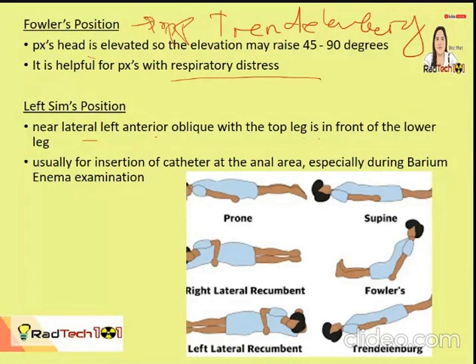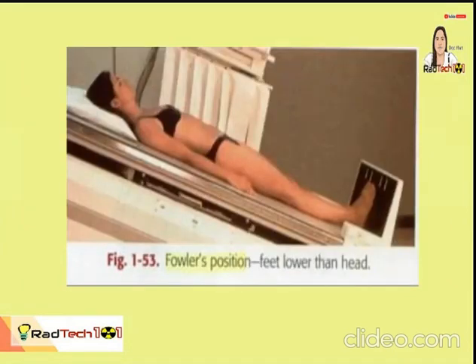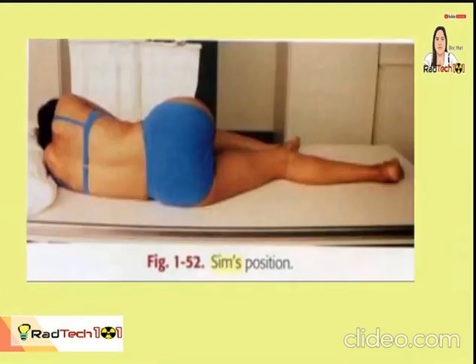Usually, ang left Sims position, piniperform siya or ginagawa siya if we are going to insert catheter sa anal area ng patient, especially during barium enema examination, contrast examination. Then, Trendelenburg, feet is higher than the head or the head is lower than the feet. This is Fowler's. Head is higher than the feet, and this is left Sims position.